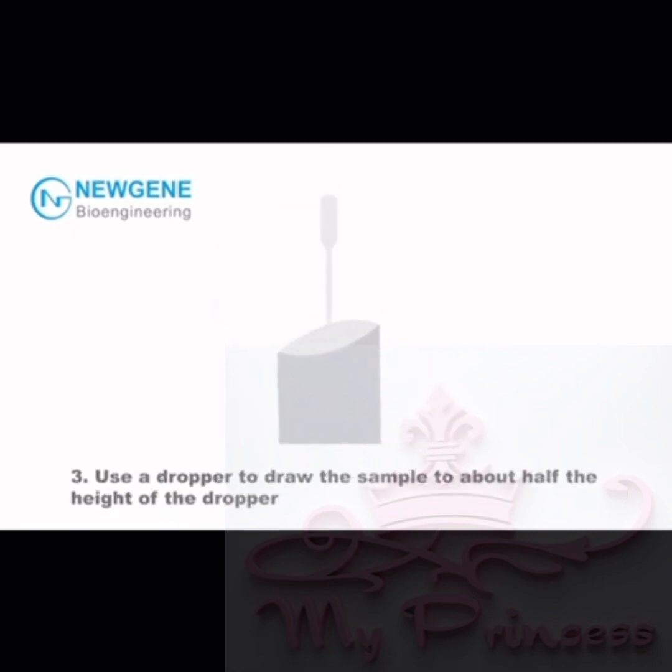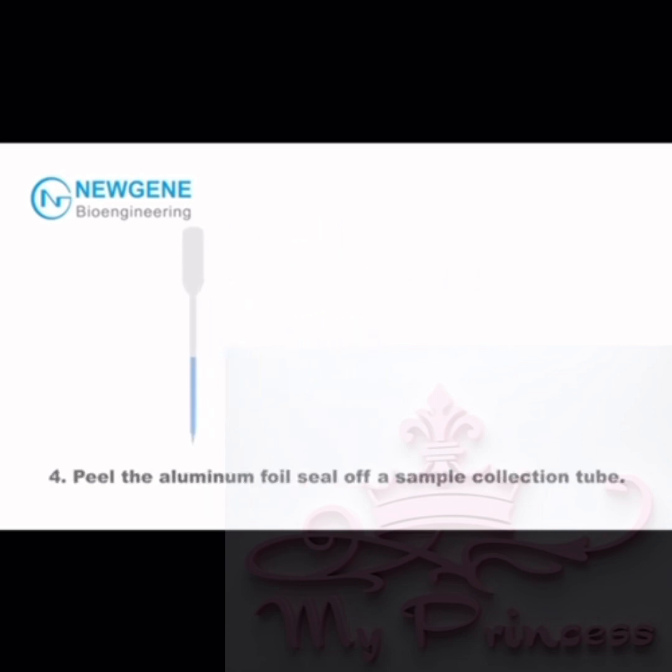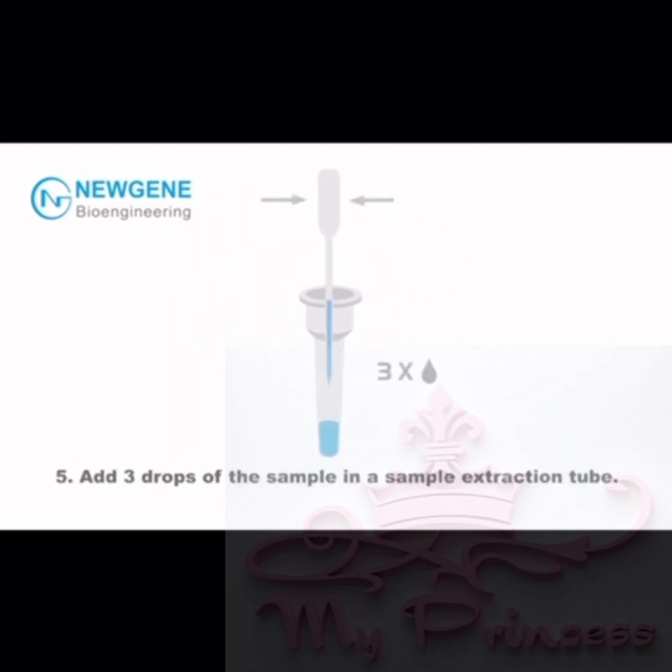Step 3: Use a dropper to draw the sample to about half the height of the dropper. Step 4: Peel the aluminum foil seal off a sample collection tube. Step 5: Add three drops of the sample into the sample extraction tube.